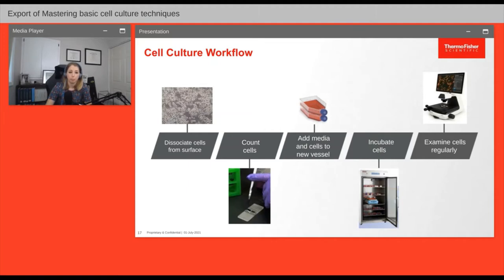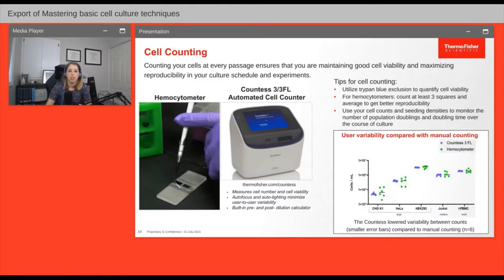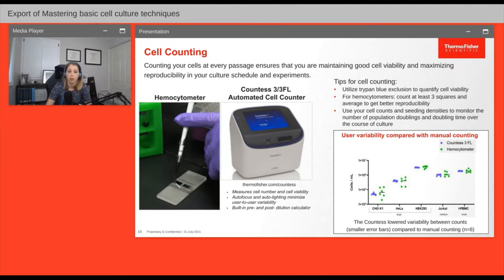Now our cells have lifted off the plastic and are in solution — the next step is to count the cells. This step is also where you would pick up if you were growing suspension cells. I highly recommend checking viability and counting your cells every time you passage so you can quickly determine if something is going wrong in your culture. The traditional way is using a hemocytometer: you add your cell solution to a grid visible on the microscope and manually count cells within the grid squares. I recommend counting a total of three of the four outer grid squares and using the average to back-calculate the concentration.